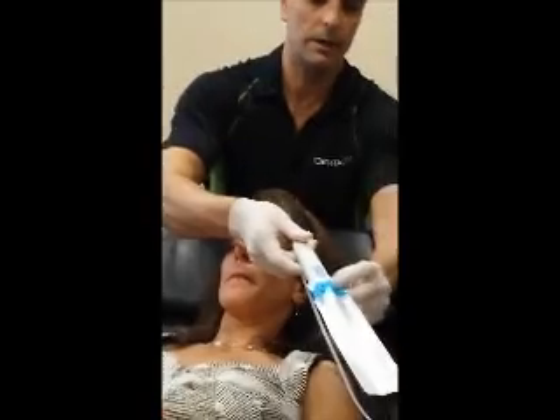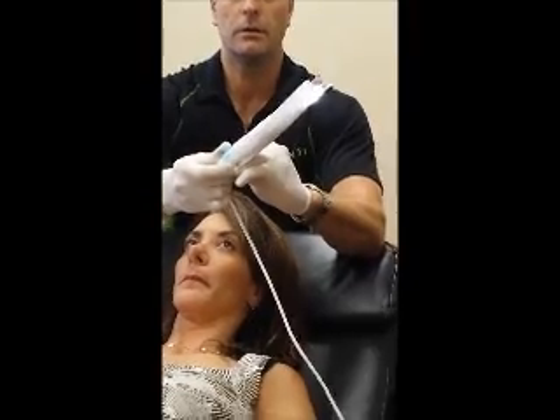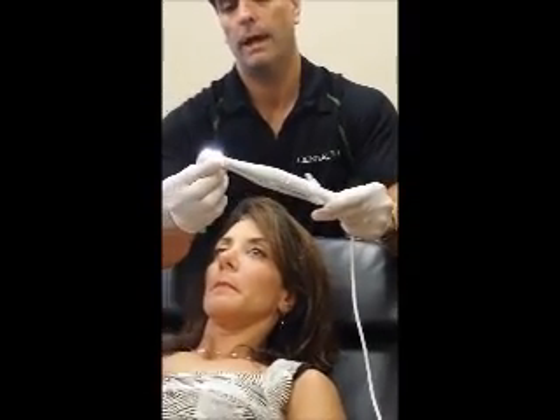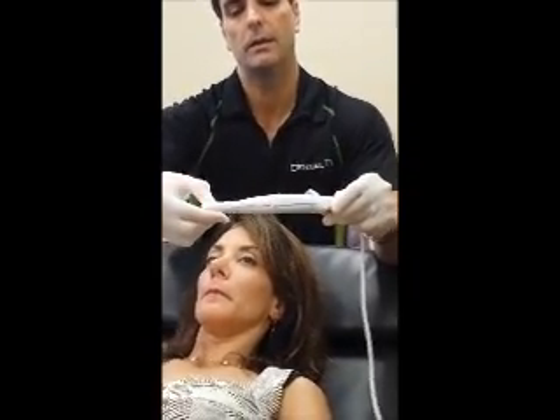Now if you want to use a sheath for this, I recommend putting the camera head straight down and pushing it all the way to the end of the sheath. Peel the plastic off. I always like to take the plastic here, back it away a little bit at the tip, and press my thumb firmly down on the plastic, because it will make it more clear and easier to see.